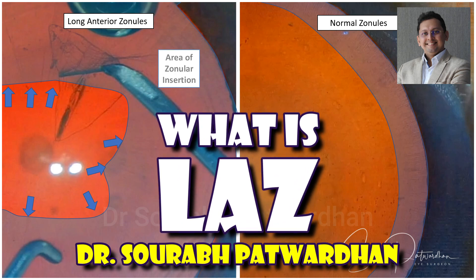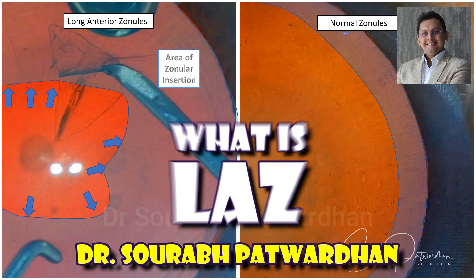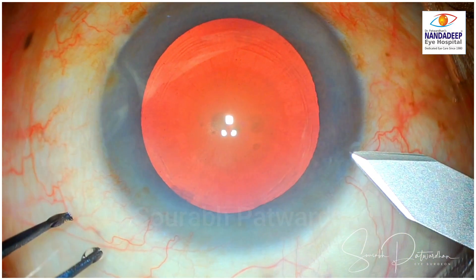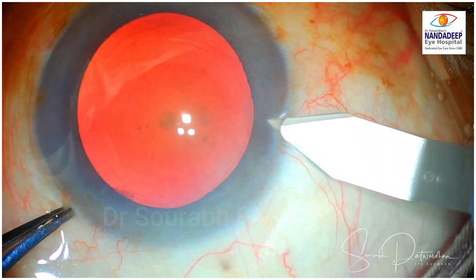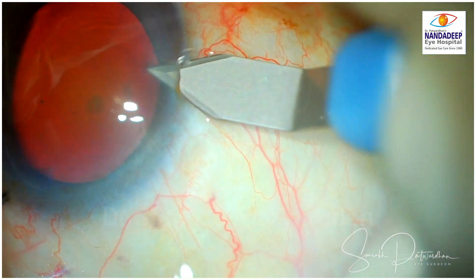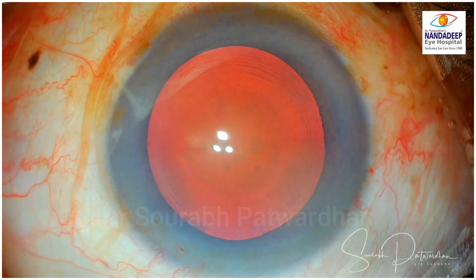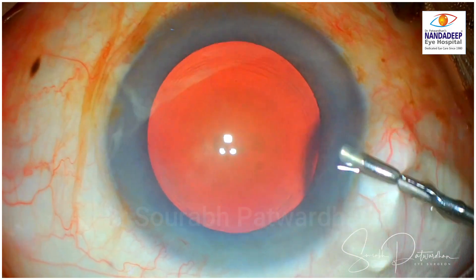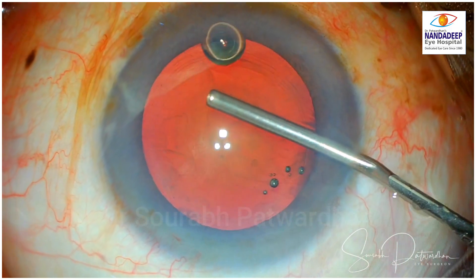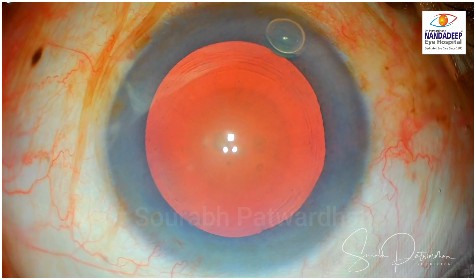So what is LAZ that we will be seeing in this particular video? LAZ stands for Long Anterior Zonules. We will find it in this particular case. When we start the surgery, we have to be careful in observing to find out this particular defect, which may have some effect on the clinical outcomes of the surgery.